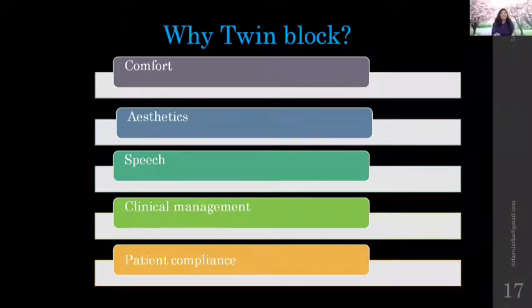It is aesthetic. Yes, over the years, when the standard twin block is made, there's not even a labial bow which could be seen from the front. Only the acrylic component along with your retentive component, no labial bow at all. So it looks very aesthetic, and speech-wise, it is very convenient for the patient to speak because there are not many acrylic components, only Hawley's plate, upper and lower, with the blocks. Because of that, the patient can speak conveniently, or else there is no problem with the speech.